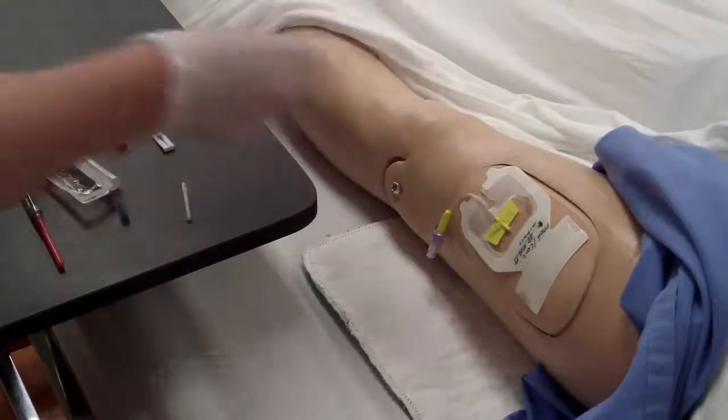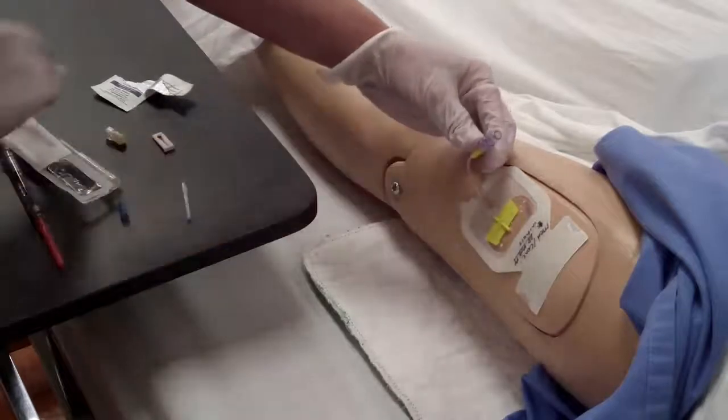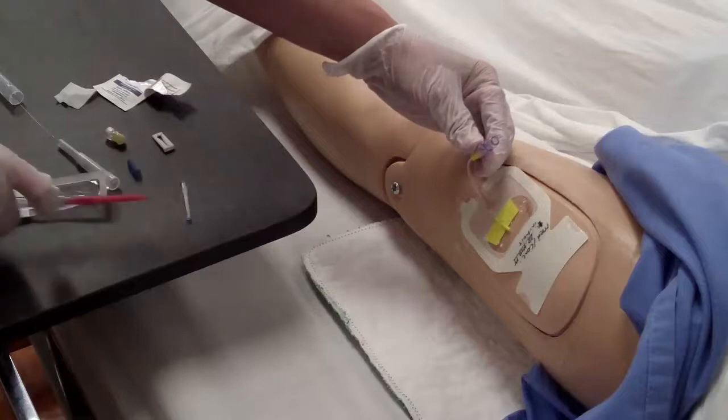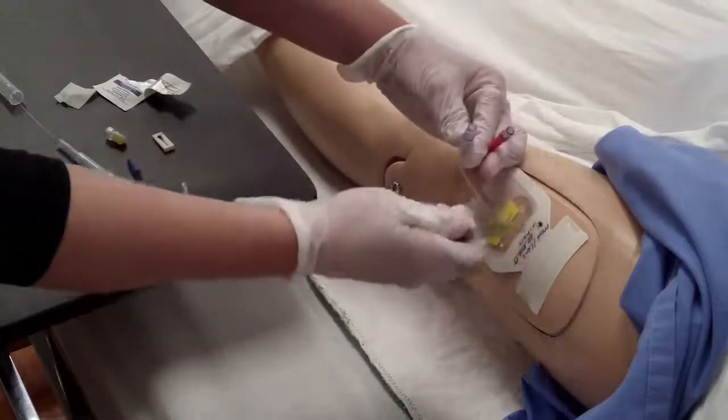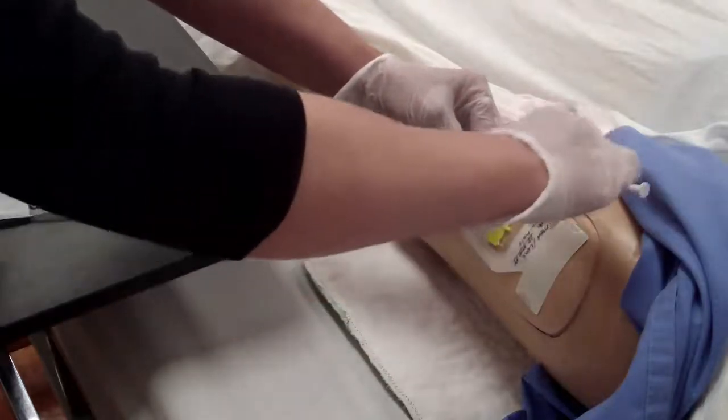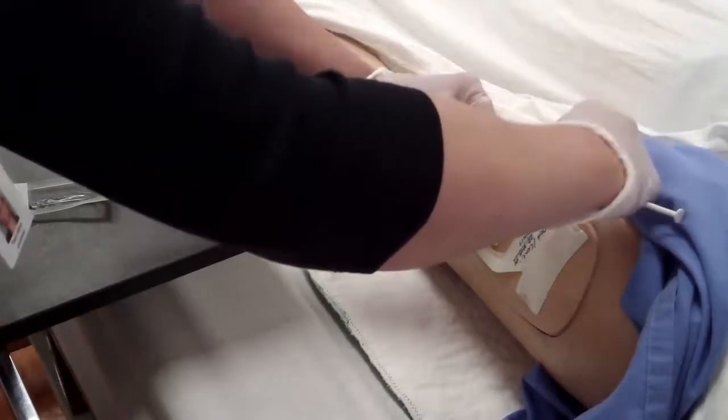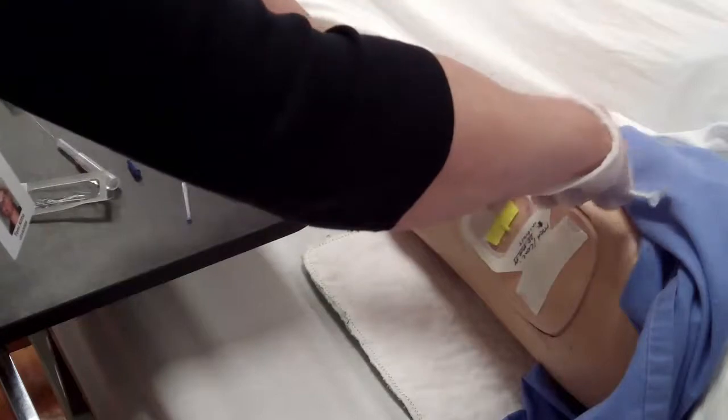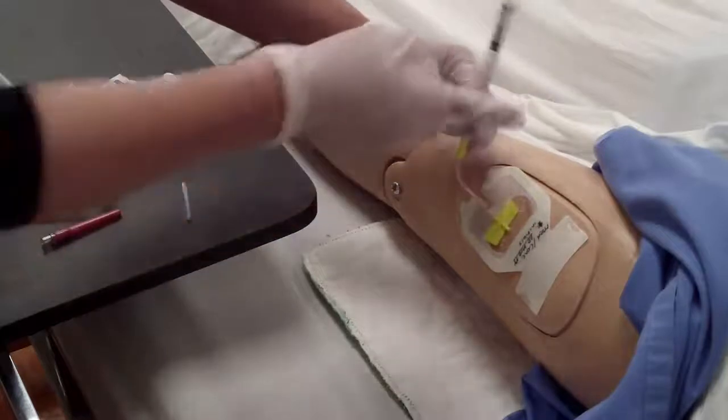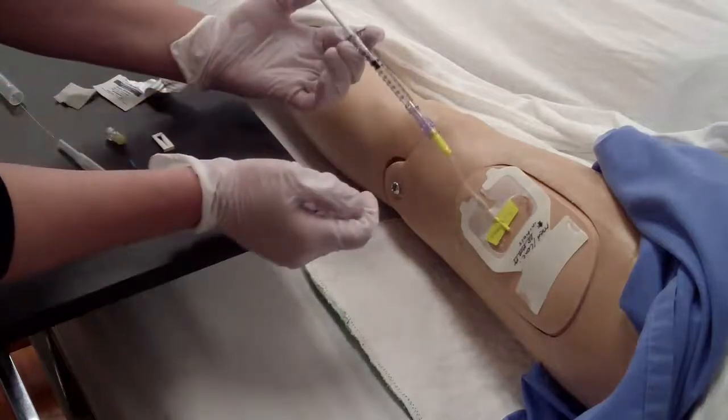You can now give the prepared medication. Clean the end of the microclave connector with an alcohol wipe and allow to dry. Remove the needle from the syringe and screw the syringe directly onto the microclave connector. This is a needleless system. The first 0.21 mils will prime the line, and you will see the medication make its way through the butterfly.